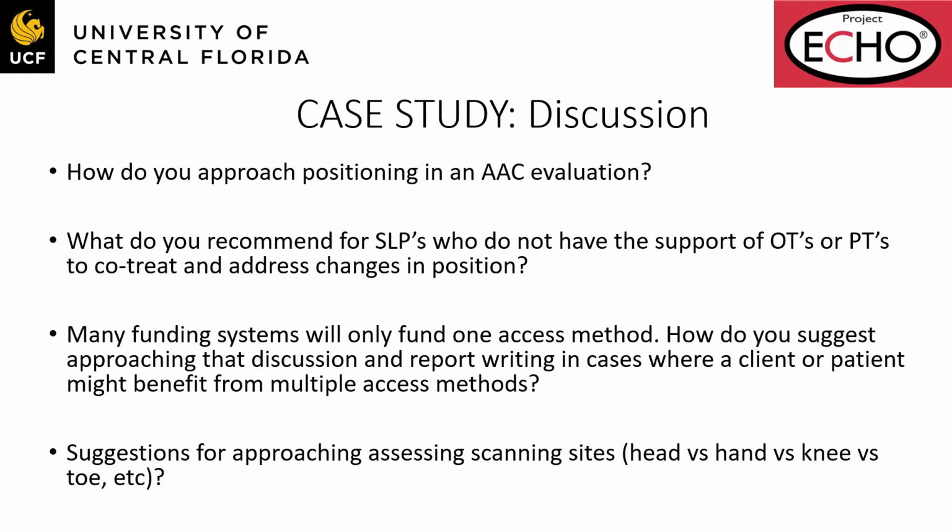We tried all those different places and got Adam's feedback about what worked well and what didn't, really trying to keep what we were doing from inhibiting his ability to decide whether it works for him or not.